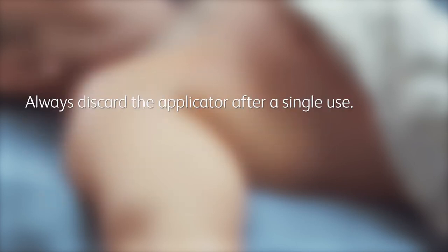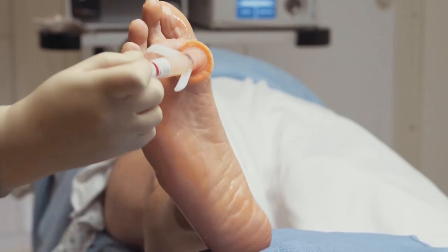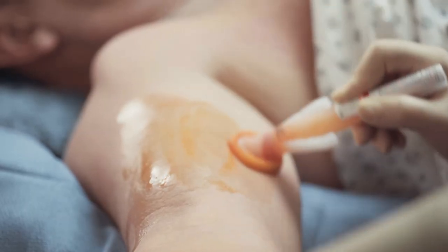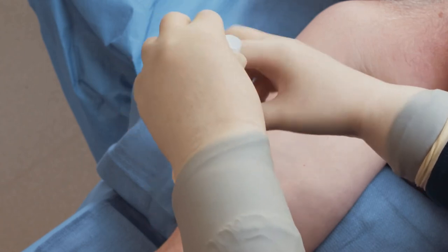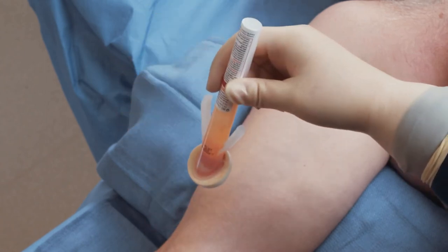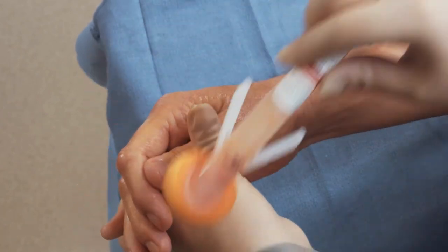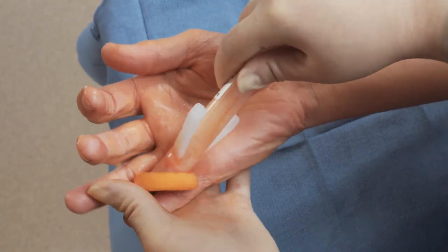Always discard the applicator after a single use. If multiple insertion or incisional areas are indicated within the surgical treatment area, each area must be treated equally for the recommended prep time. It may be necessary to use multiple applicators depending on the surgical area. It is not necessary to restart application at the insertion or incisional area if you have already completed the appropriate prep time for that section.